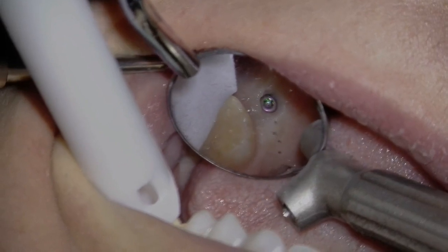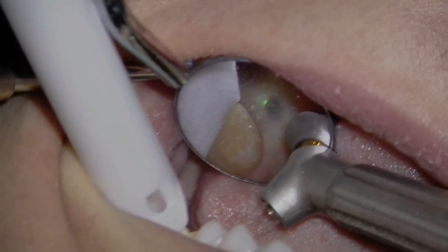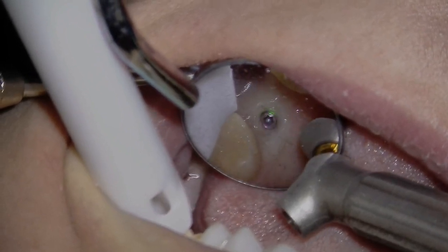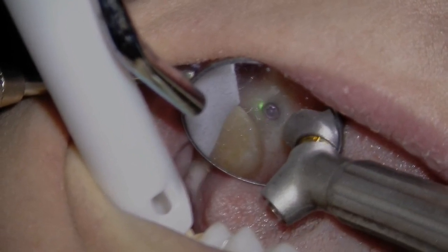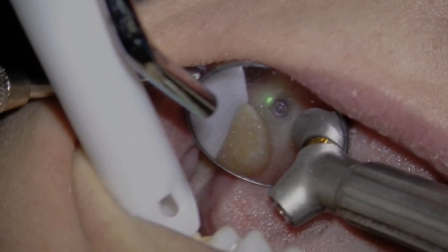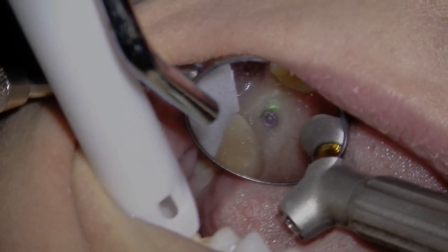The clinical objective was to uncover the implant and allow ideal tissue contours for a screw-retained implant restoration. The patient was anesthetized with injectable anesthetic due to high levels of dental anxiety, yet only a few drops were used directly over the implant. The entire procedure was performed blood-free using Solea.